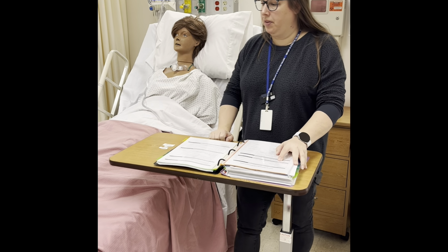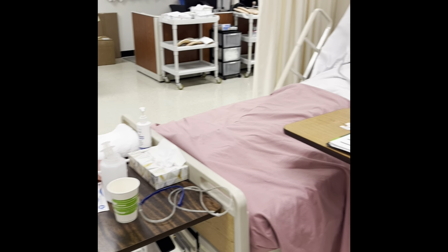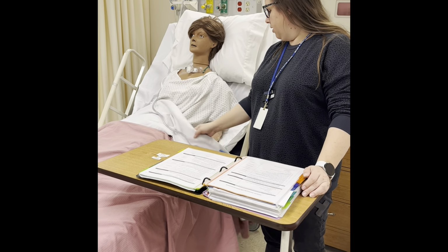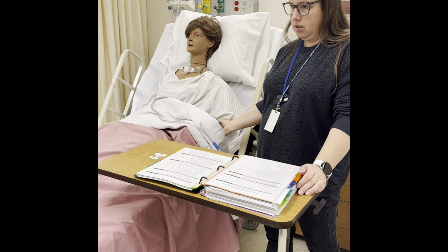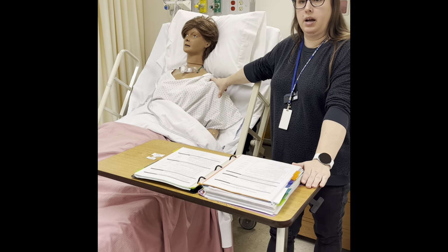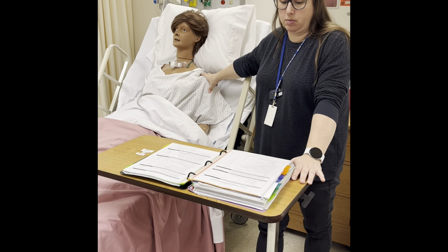Then it tells you to gather all these supplies. They'll all be sitting out for you, every single thing that you need in front of you. Then we knock, introduce ourselves, and check patient identifiers. She does not have a wristband on, so we'll just pretend. It's like Judy Smith, 10/2/1963. Ask them their allergies. We're here today to put an NG tube in. We're going to give you some medications and we're going to remove your tube. So that's what we're doing today.